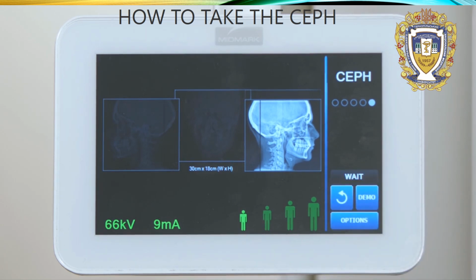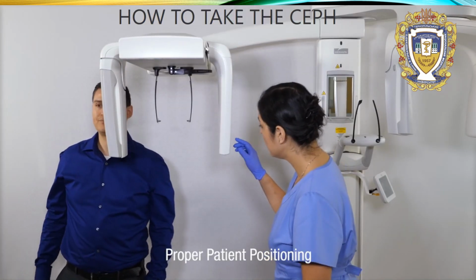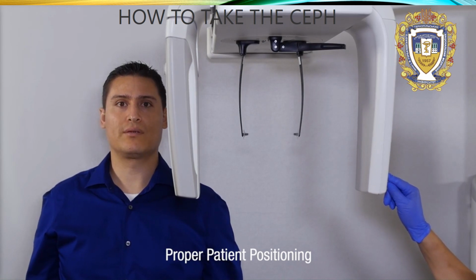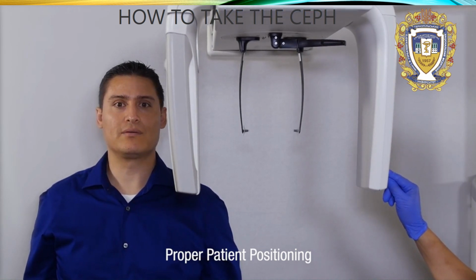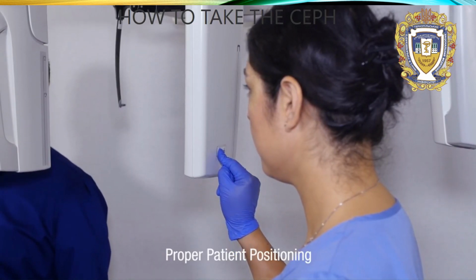To begin the image acquisition, tap the Ready for Imaging button on the touch control panel. The status indicator flashes to indicate a moving status while the Vantage system moves to the ready position. Once the Vantage system is ready to perform a scan, the status indicator will change to the green ready state. With the patient standing next to the unit, visually compare the height of the patient's otic canal with the cephalostat ear posts.